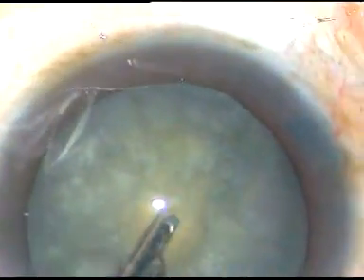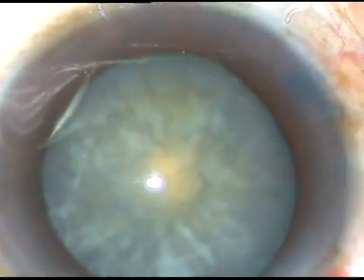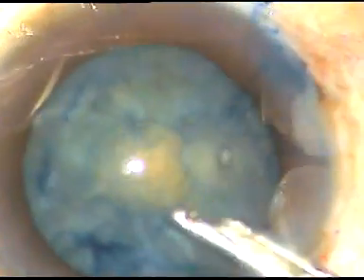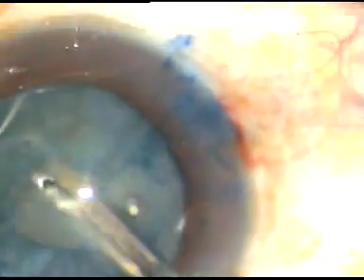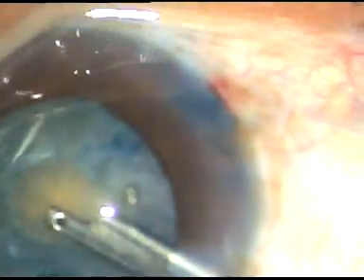You can use a bimanual irrigation-aspiration if you want to perform the same maneuvers. Since the staining was not good, I am injecting here again and want to do some more staining. This time, the staining is good and we can see the small rexis very well. I remove some more cortex through this mini rexis opening.